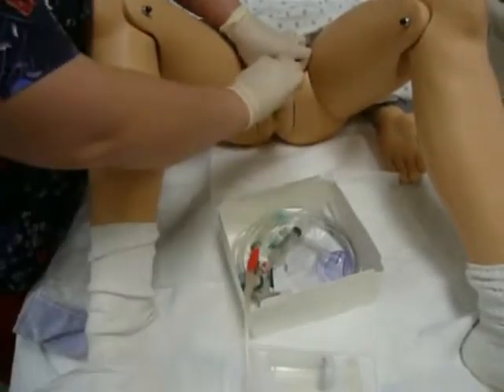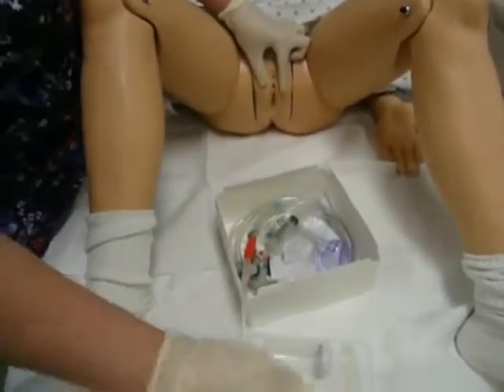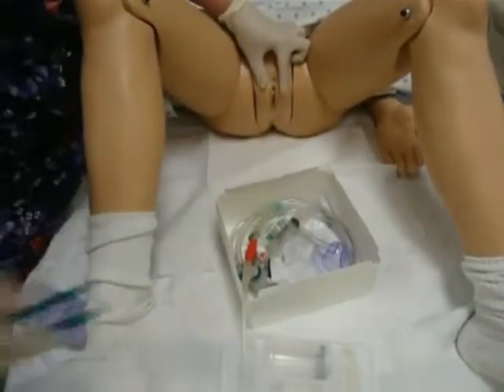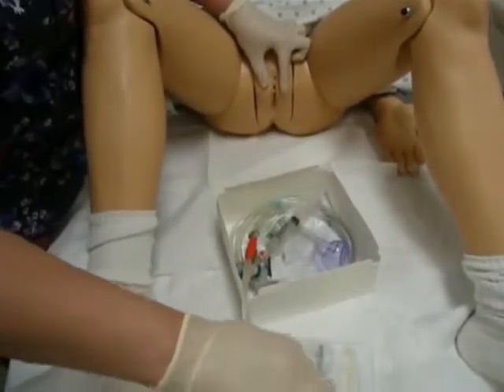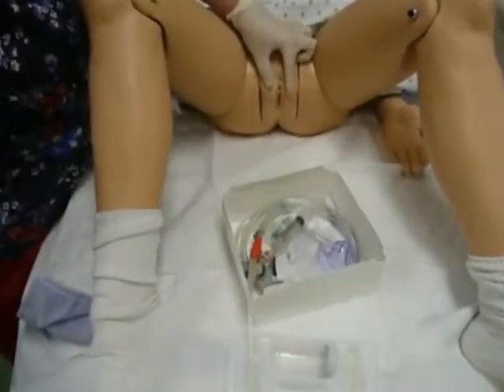Grab my next cotton ball and do the next one, and I come around and my third cotton ball and do the other side. Now for females you may have to use all five cotton balls that come in the kit, which is just fine. So you can go ahead and finish up with your last cotton ball and come around the sterile field.